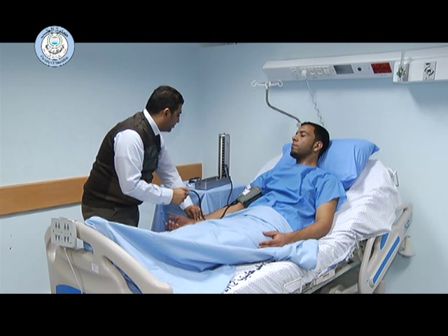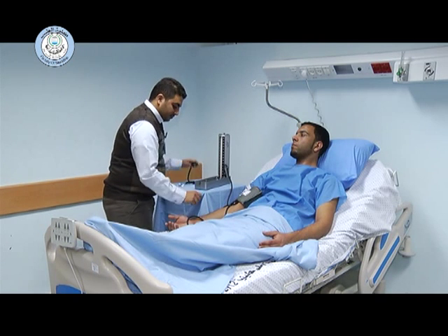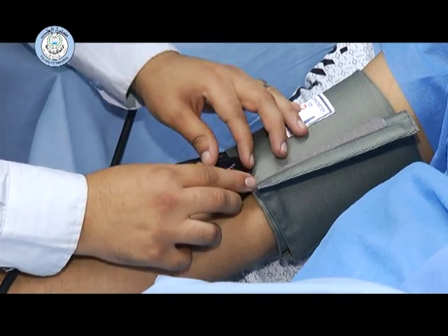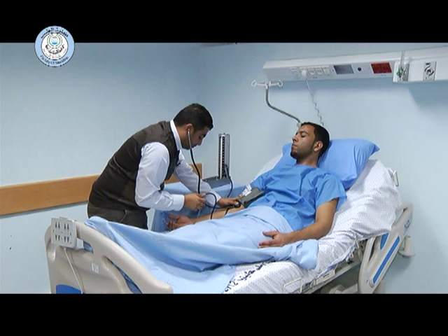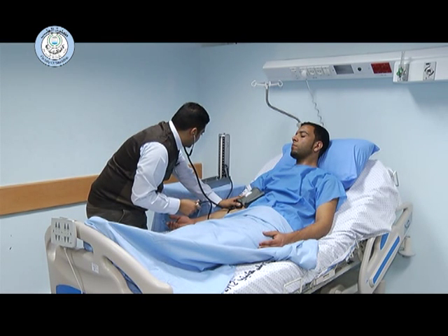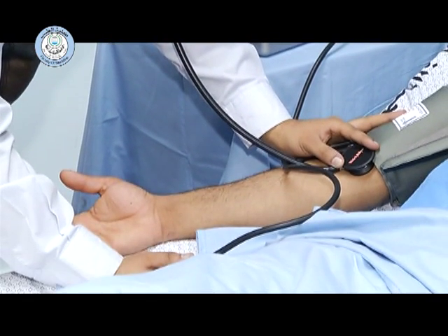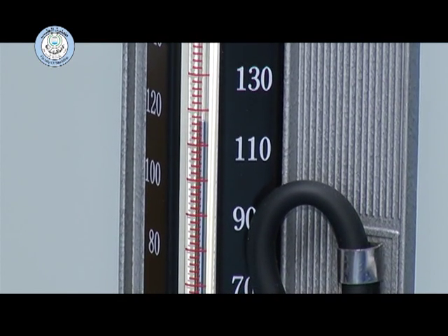After that, we inflate or over-inflate the cuff 20 to 30 mmHg above the estimated systolic pressure determined by the palpatory method, then perform the auscultatory method. We deflate at 2 to 3 mmHg per beat. The first sound heard is the systolic blood pressure, and the disappearance of the sound is the diastolic blood pressure.